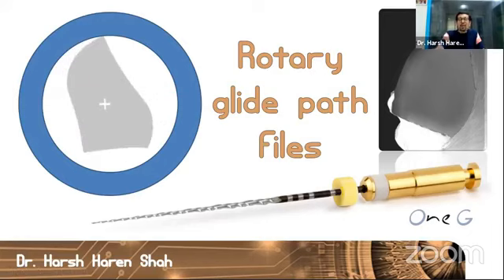How does this help me? It helps me in many different ways. The first thing is, because only one edge is cutting the dentinal wall, the file is very free to move inside the canal. There is not much of torsional fatigue that is acting on this file, because of which chances of separation or damage to the file are greatly reduced.